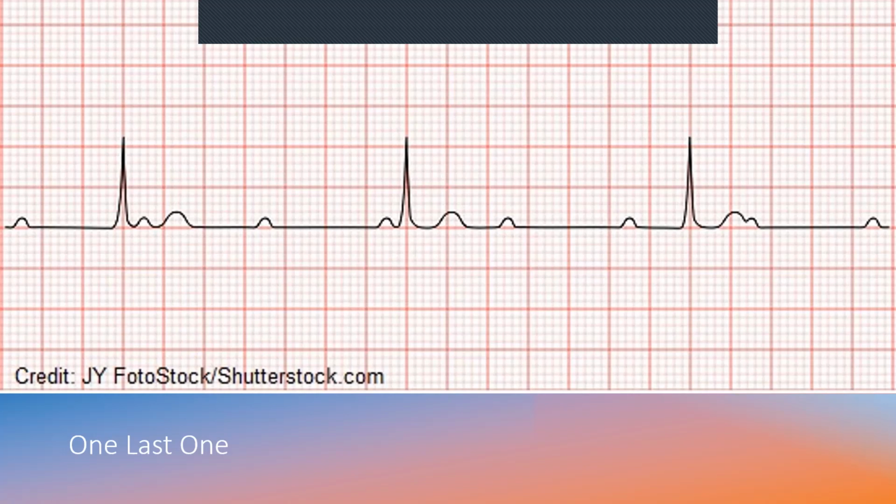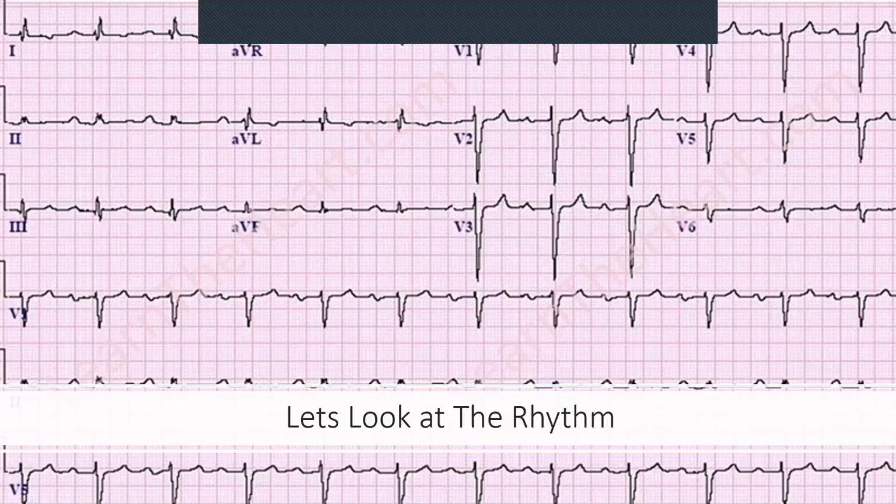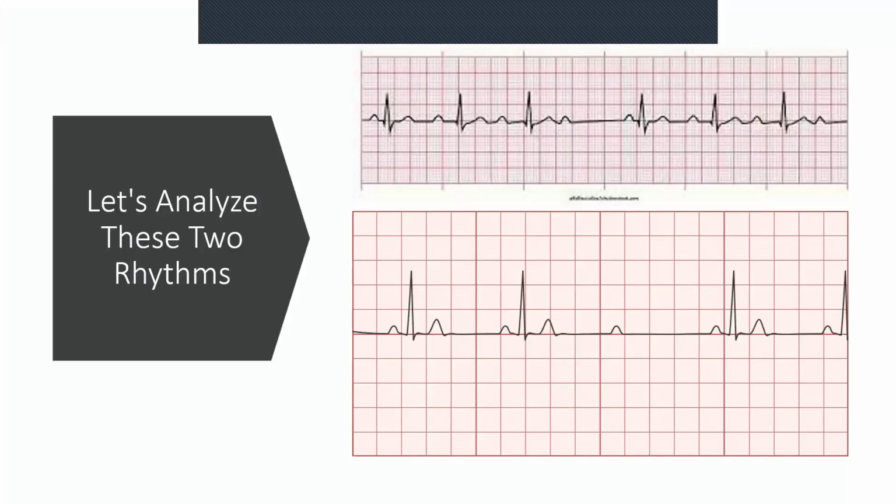Okay. So let's just recap it one more time. So first degree heart block, PR interval is long, right? But it just stays long and nothing else happens. All right. Mobitz type 1, PR interval gets longer and longer. Eventually, a beat will drop. Sometimes, I know in the ACLS exam, they throw in one where the beat doesn't drop. Everybody panics, yeah. Everybody panics because now they don't know the answer, right?